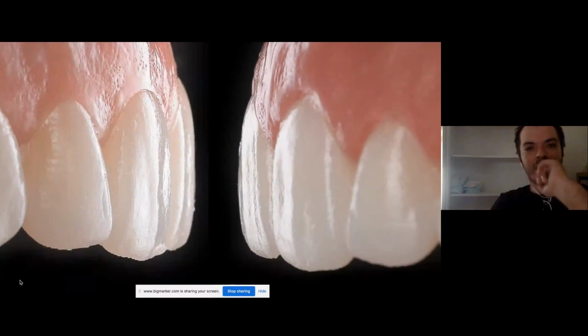But the main thing here is you can see the sequence. Whenever you do a motivational design and you don't have an additive case, you always need two designs. The first is to properly help the patient visualize the end result and to give you the acceptance to do the clinical procedures, which are invasive. After you get the consent, then you're going to use the second design. What's the only difference between them? Sagittal position of the library.